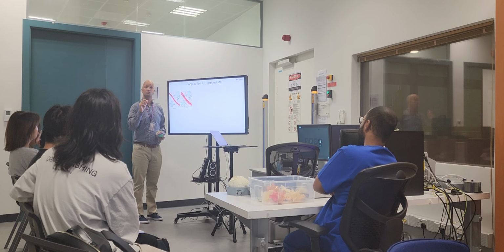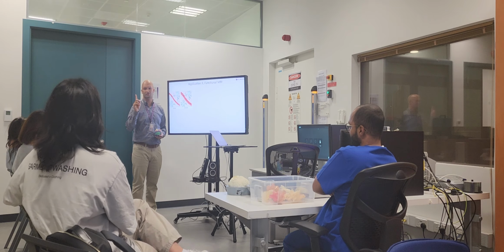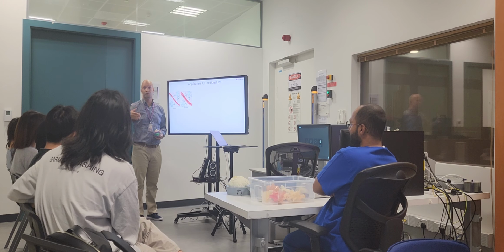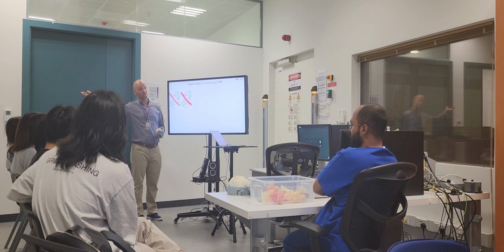So with T2 star, you usually see the effect of T2 star when you do a single pulse and acquire. The longer your readout, the more sensitive you are to T2 star. But you understand spin echoes, right? Let's say you do a 90 degree pulse and then you get an echo that decays quick. The 180 degree pulse is going to revive that echo, and then you study T2.